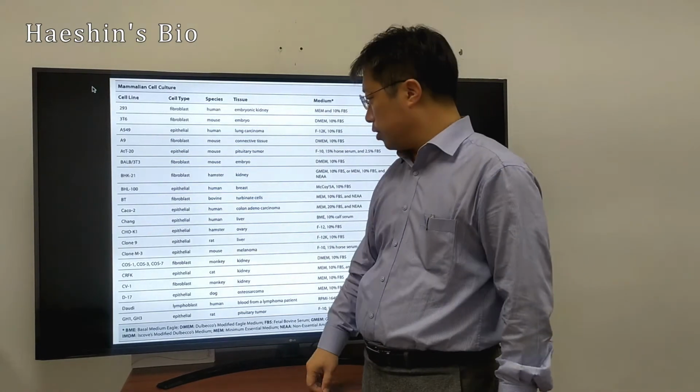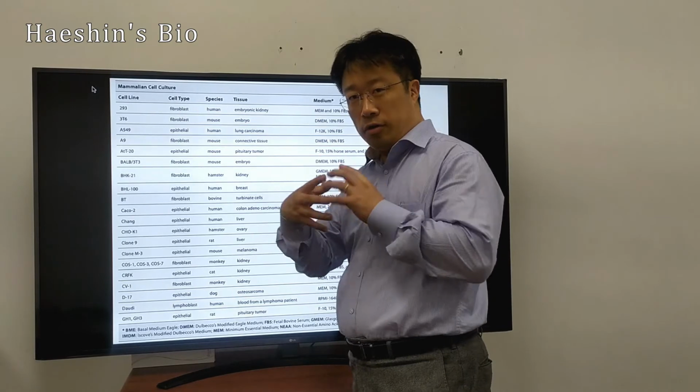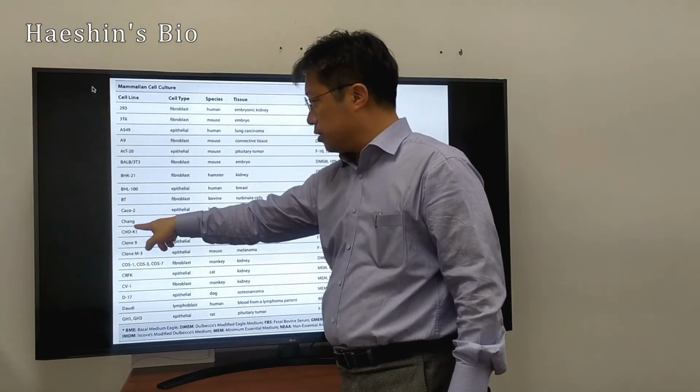So liver, and epithelium means the outside of the liver. So that is called the Chang cell.